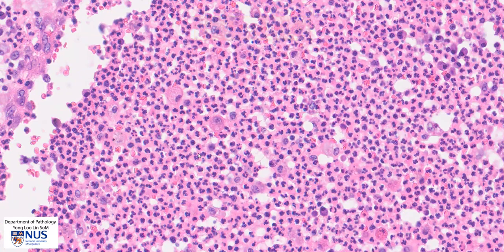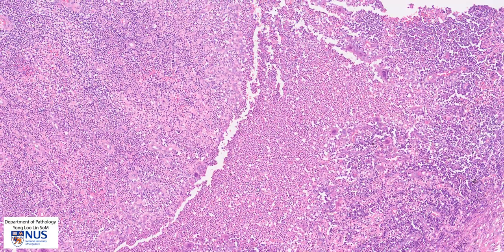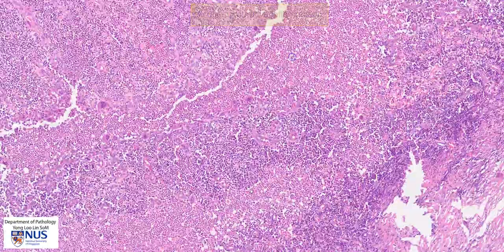There is also some granular necrotic cellular debris. We don't actually see any bacterial organisms here, but these may sometimes also be visible. So we have acute suppurative inflammation with necrotic debris and lots of neutrophils.